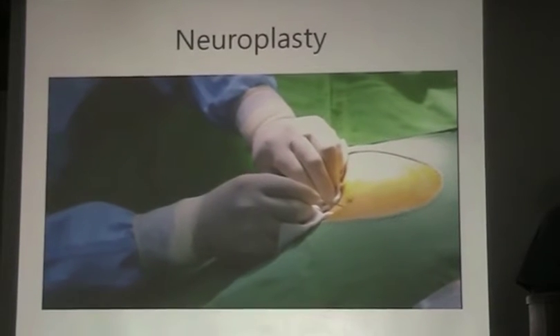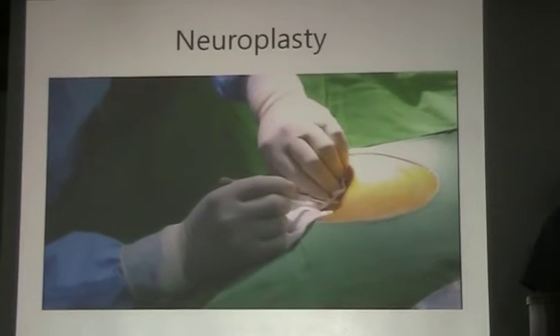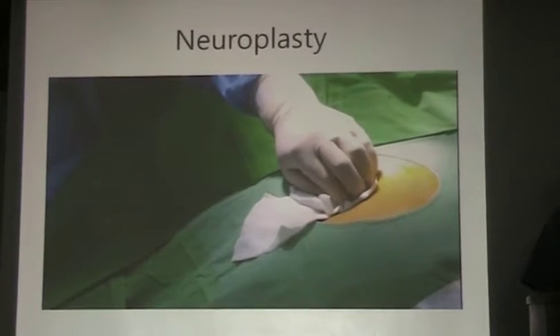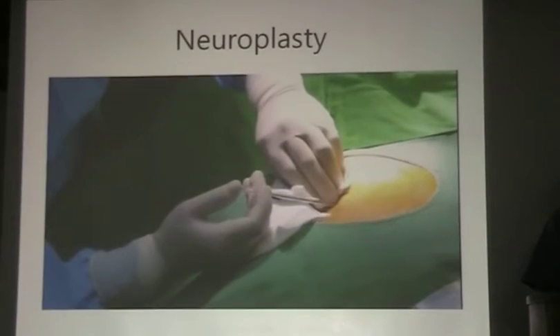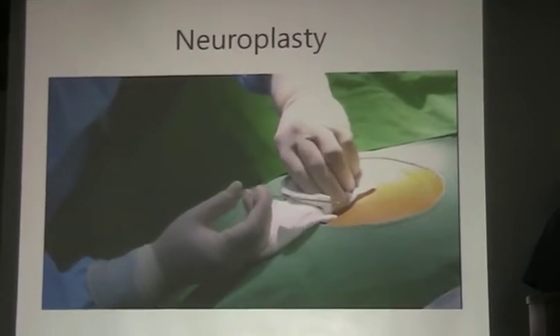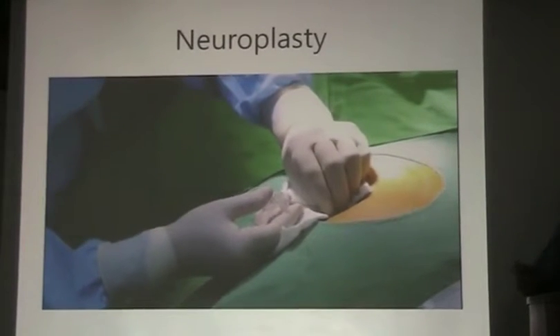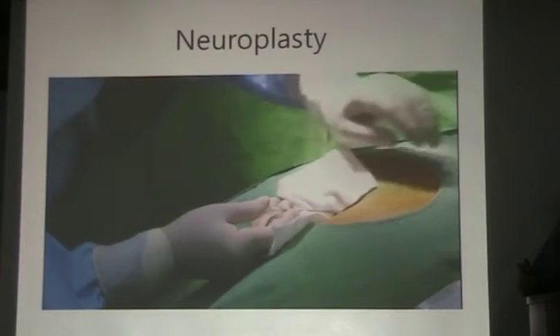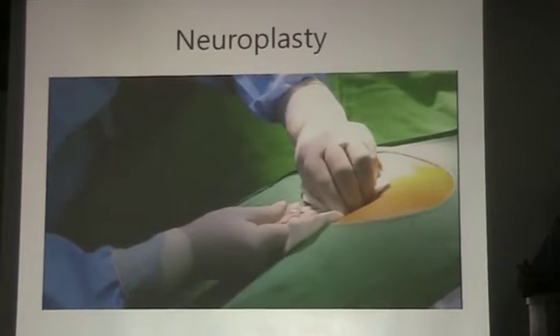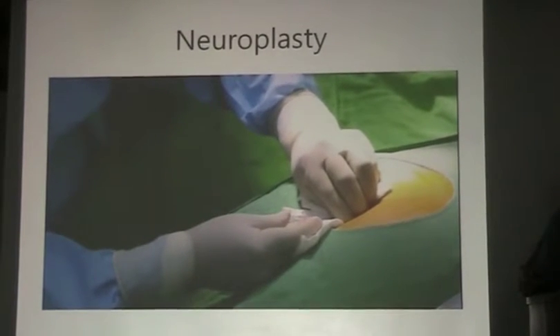And make entrance to the sacral hiatus like this, and a small skin incision. And trocar insertion. It is very important to make the entry point parallel to the caudal space, the sacral space. Insertion of the trocar like this, gently.